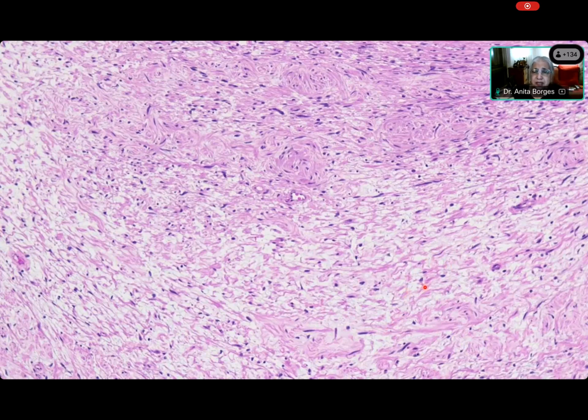It is as if somebody has taken, you know, when we were in school, you used to use a nib and dip it in ink. I don't know whether you do it anymore. If you have a thin point to the nib and you do little marks with that nib, this is how there is nothing finer and thinner than the spindle cell nucleus of this tumor.